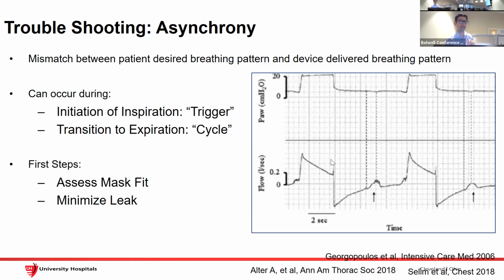So what the device does on a spontaneous BiPAP, okay, this is super important. How it triggers, again, trigger means going from EPAP to IPAP. How it triggers is usually by a flow, okay? And this is a parameter you set in the machine. It says trigger, and you put in something liters per minute. How many liters per minute does the machine sense that you're pulling in or inspiring for it to say, oh, you're breathing, you're inspiring, let's go to IPAP.